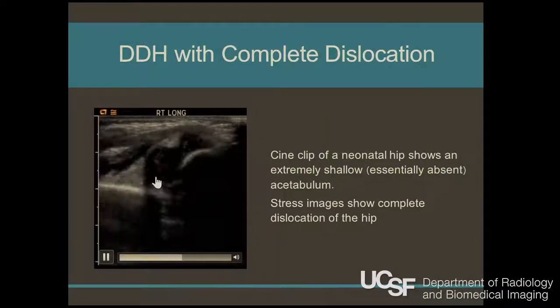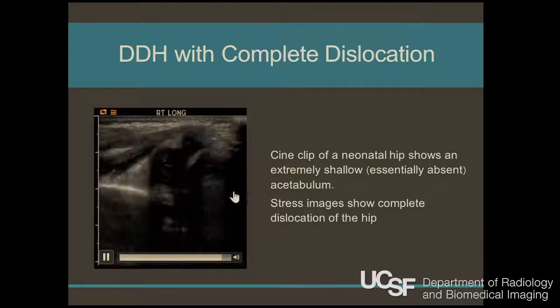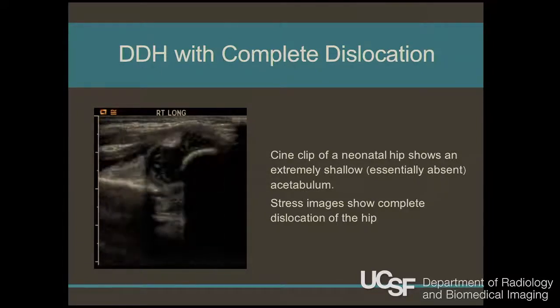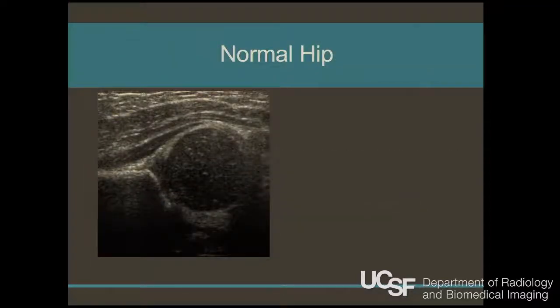The reason I wanted to go over these is because neonatal hip studies, which many of us are asked to do, are one of the toughest studies to technically do. And if you don't know what you're really looking for on top of that, it makes it even more difficult. And the fact that we look at these in this weird orientation, I think, causes a lot of people to get confused. So for better or for worse, this is how we look at a neonatal hip ultrasound.